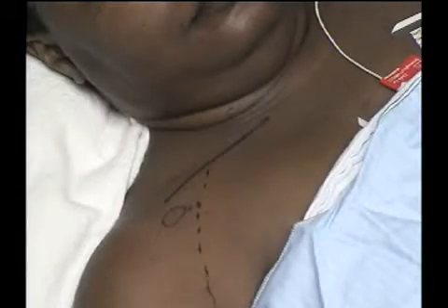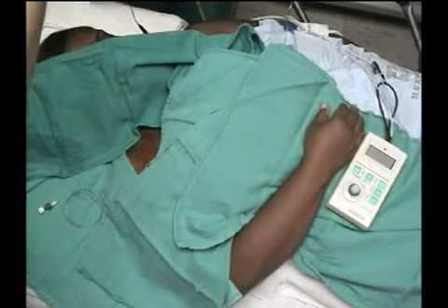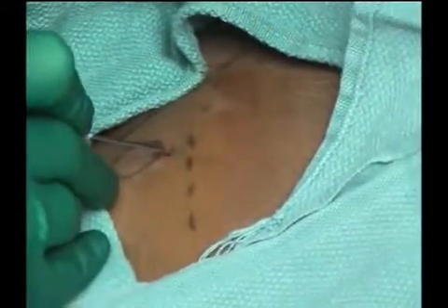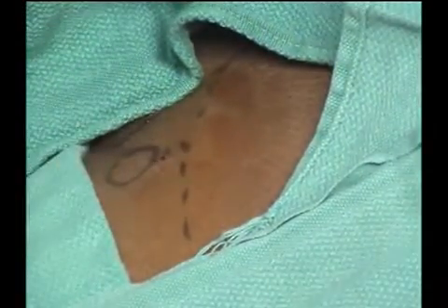The vertical technique. The patient is placed in a supine position. A line is drawn between the anterior acromial process of the scapula and the jugular fossa, with the shoulder pushed downward and the arm across the body. The midpoint of this line, immediately below the clavicle, is the site of the introduction of the needle.